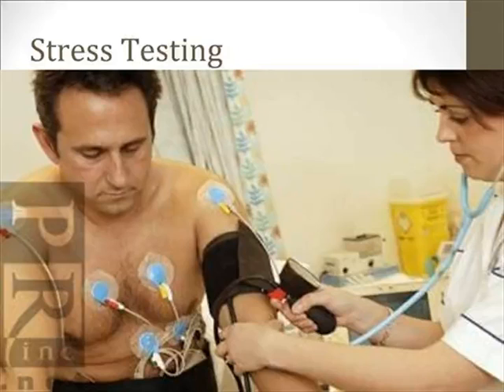An exercise stress test is a non-invasive way to measure cardiac function during physical stress. It is primarily useful in determining the extent of coronary artery occlusion by the heart's ability to meet the additional O2 demand in response to the stress of exercising in a safe environment. The patient exercises either on a treadmill or a stationary bike to increase the cardiac function or heart rate somewhere between 80 and 90% of maximum heart rate. The patient's ECG and blood pressure are monitored during the test.